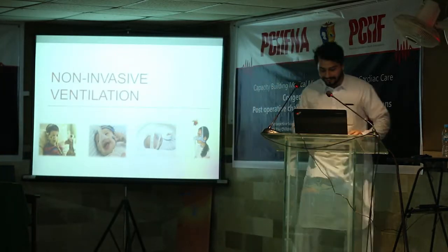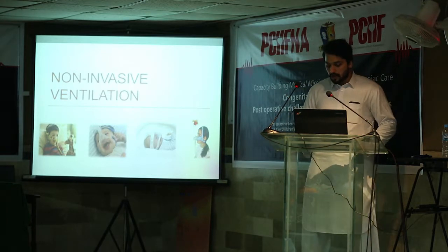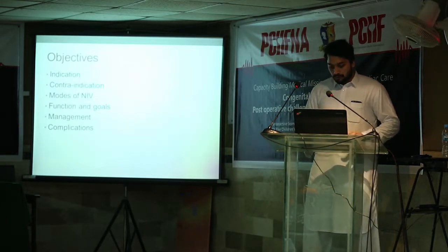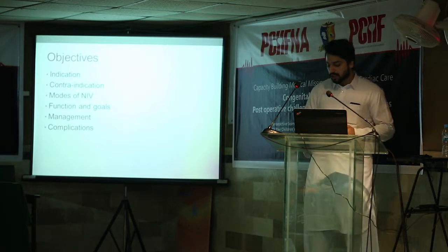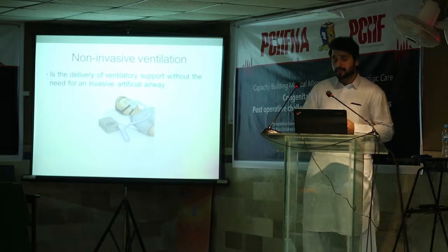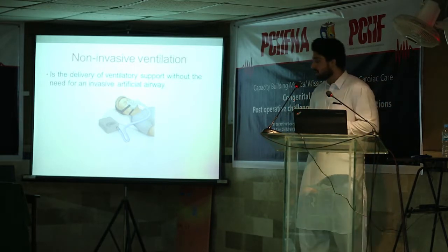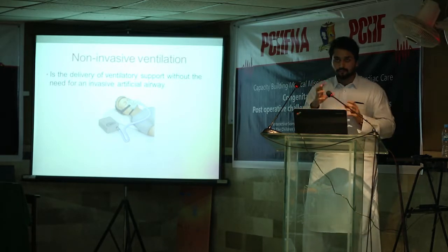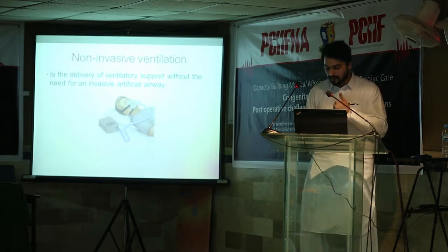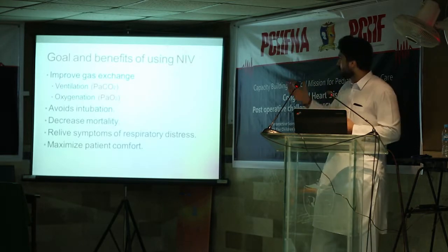So now let's talk about non-invasive ventilation, NIV. My objectives are the indication, contraindication, modes of NIV, function, complication, and management. So what is non-invasive ventilation? It's ventilation without an artificial airway. Without any invasive ET tube, we can ventilate the patient. That's non-invasive ventilation.